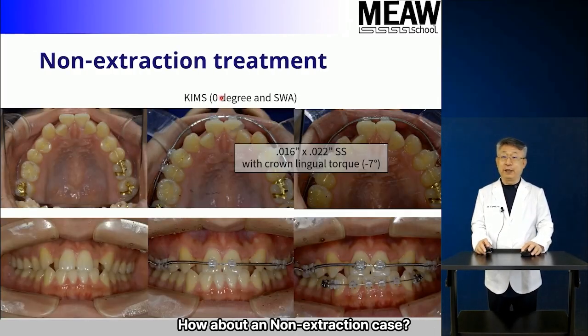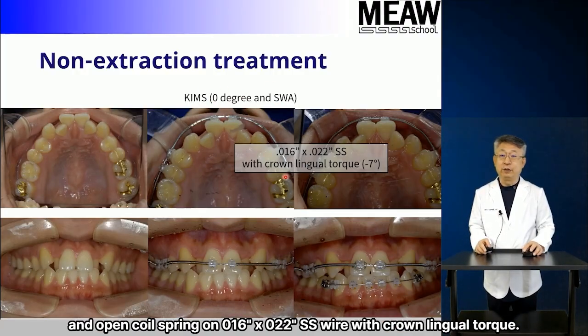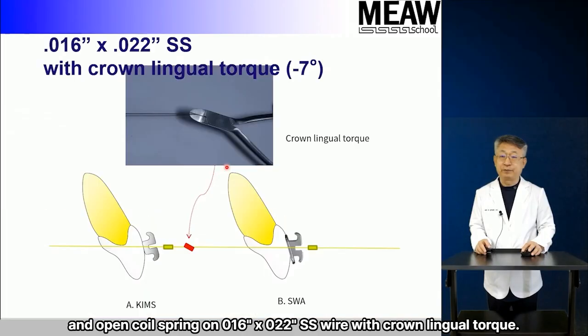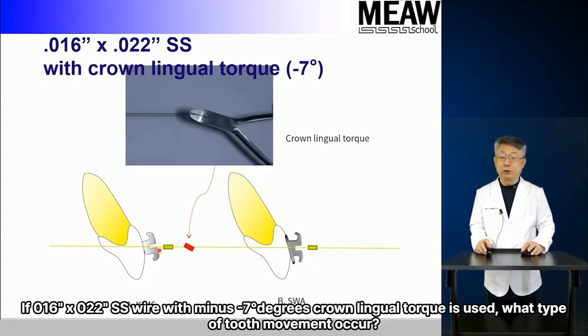How about a non-extraction case? In order to minimize the labioversion of the upper incisors, use Kim's brackets, which are SWA brackets with 0-degree torque, on the upper four incisors, and open coil spring on 0.016 x 0.022 SS wire with crown lingual torque. A shows the 0-degree Kim's bracket and B shows the SWA bracket.